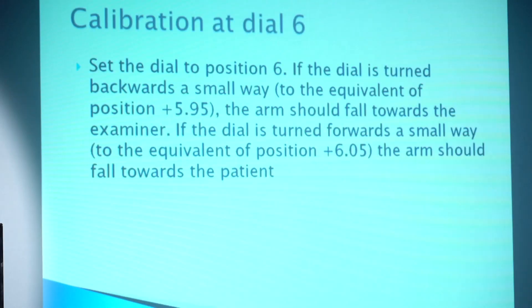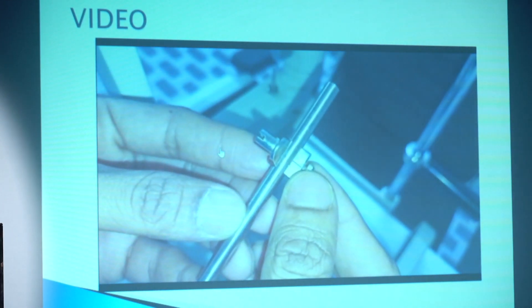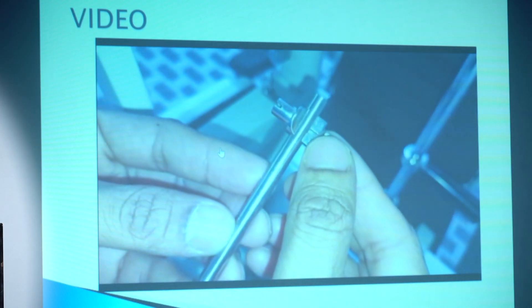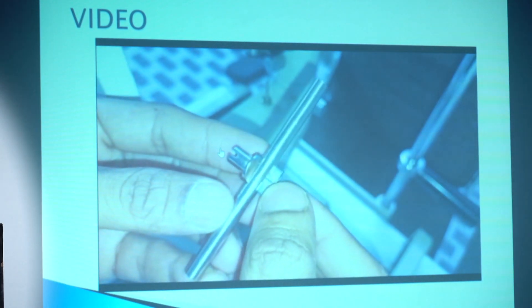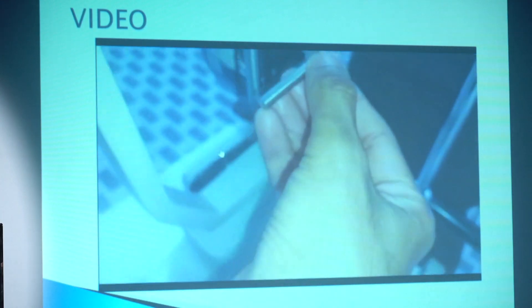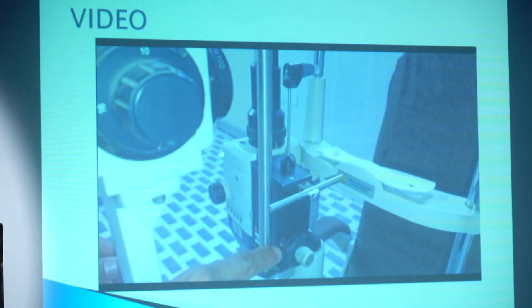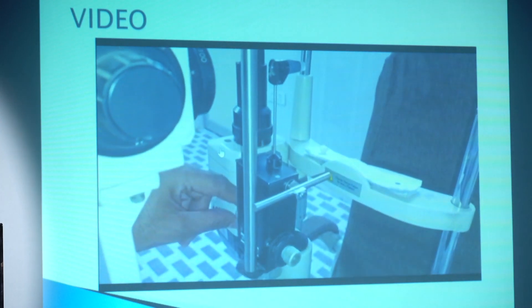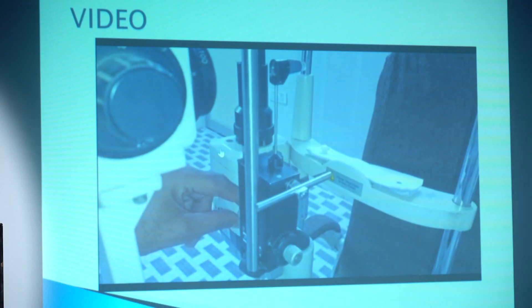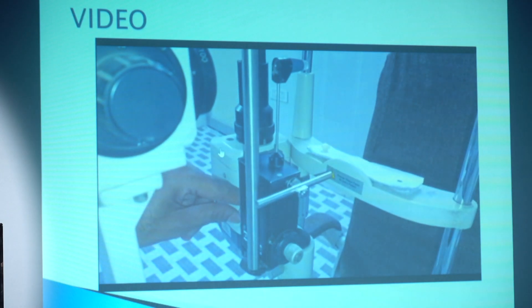I will now demonstrate calibration through a video. This rod — the center point is 0, then the next position is 2, which equals 20 mmHg. The last position on the tip side is 6, equivalent to 60 mmHg. Put the instrument in the 0 position and start calibration. The knob should also be at 0. Focus on aligning 0 toward the prism. Movement of the prism is important — first forward, then tilted slightly.